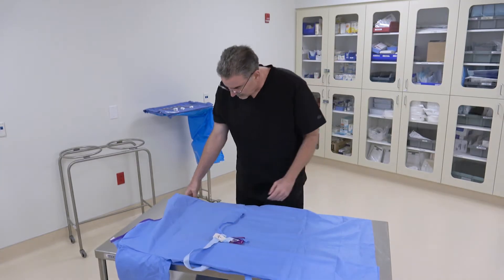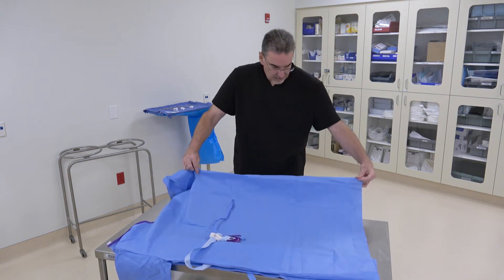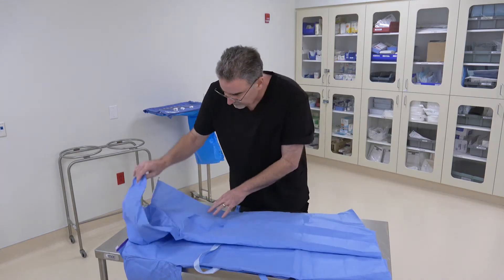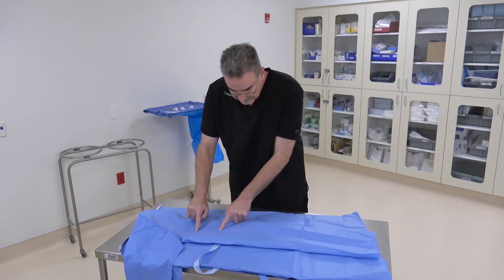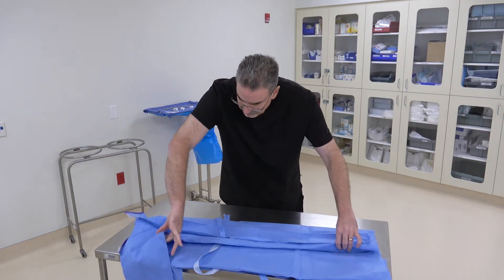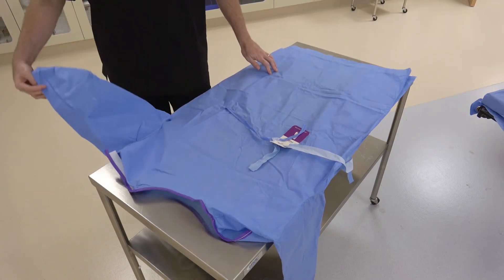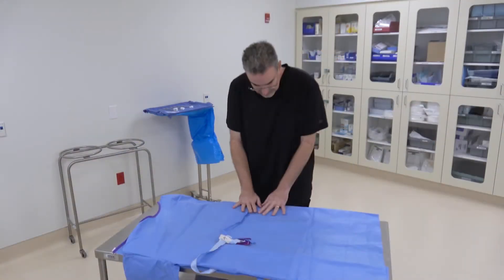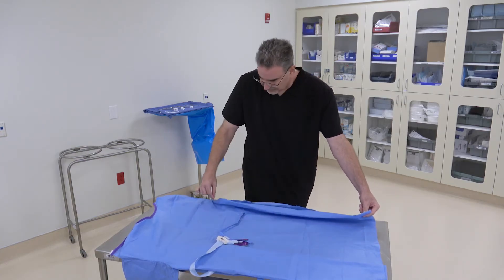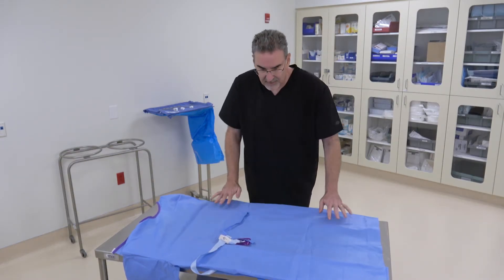Do exactly the same thing on the other side. Find the armpit and the ridge that runs down to the bottom of the gown, fold it over, find the valley, fold it up so that it meets, then take the arm and fold it back over. Ease the arm down so it's all lined up nice and neat — the ridge coming out from under the armpit is lined up with the edge of the gown.